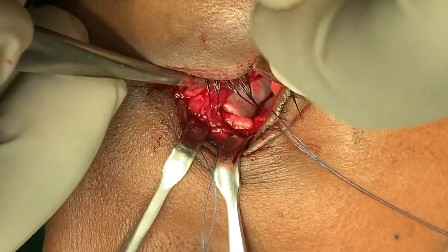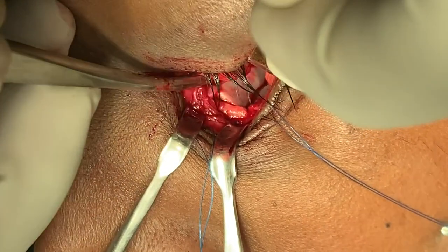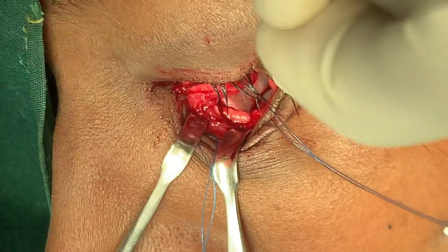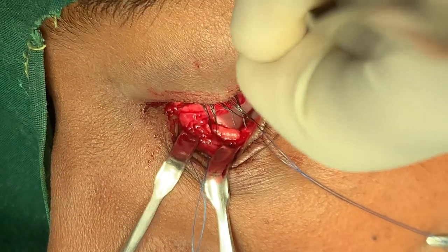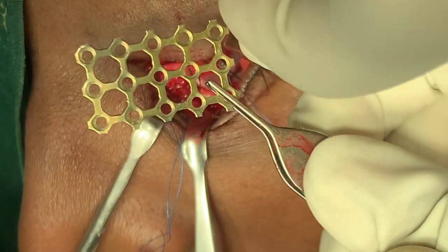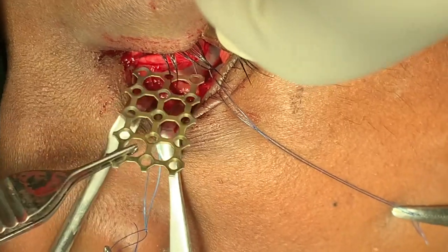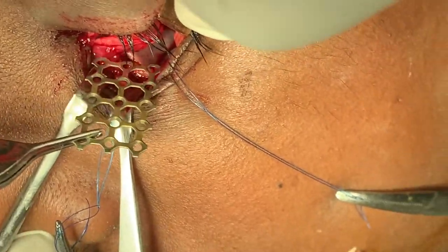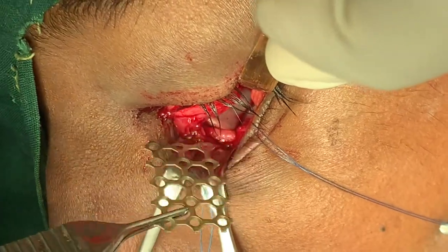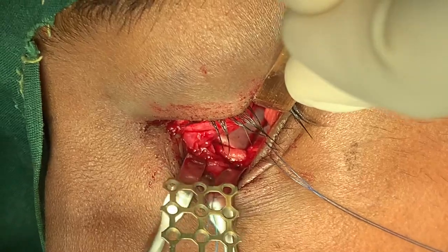Totally fractured, mobile, loose bone. That I'm going to use the mesh. It's going to bridge these two. It's really difficult for me to take the video and show you everything. Give me the mesh now. I'm going to show you what mesh. Yeah, that's the mesh that we've got. We're going to use this mesh in a longitudinal fashion. After we finish this video, I'm going to adapt this so that two screws would go on either side and this would go into the orbital floor.